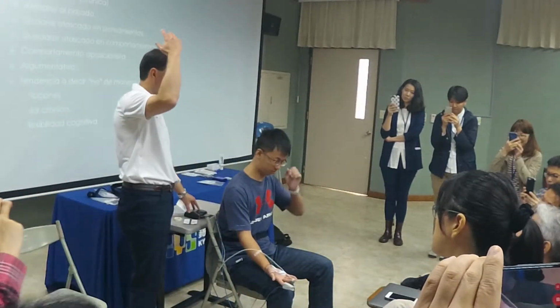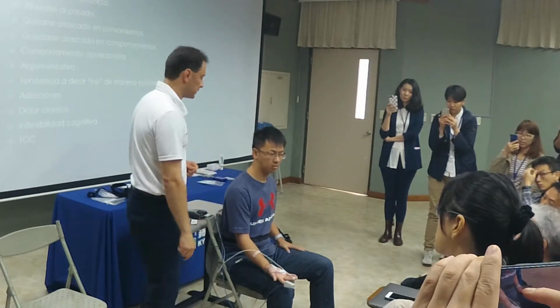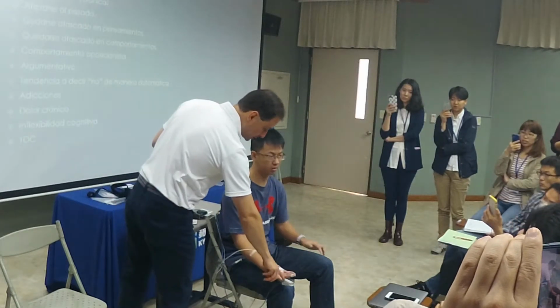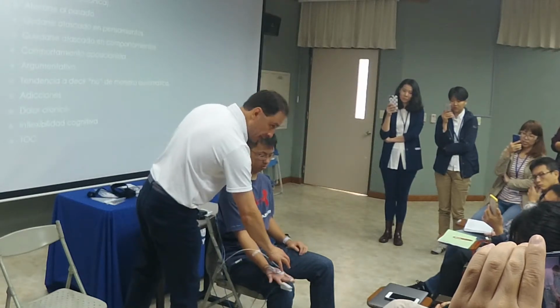So I'm going to swing across the room, right? This one? This one. The galvanic skin response. Right. This one, that's blood temperature. Yeah, it's measuring how much blood flow is going there. So that's your heart rate. So let's rephrase. That's your respiration. This is your heart rate. This is your temperature and your galvanic skin response.